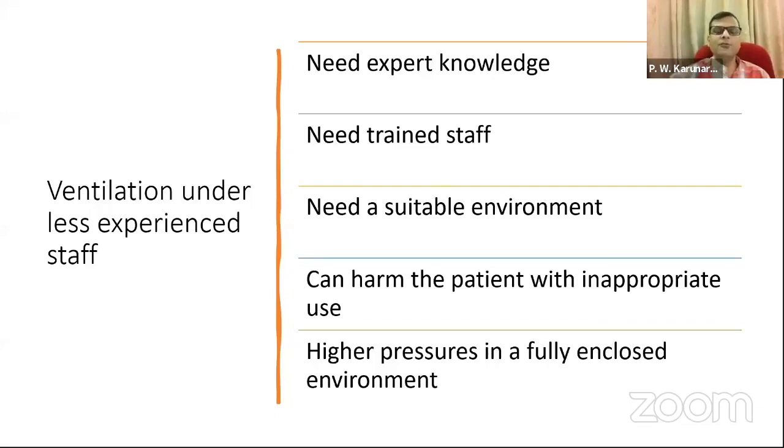At the same time, if you use these portable ventilators inappropriately, they can harm the patient very easily, because, as I told you last time, in an invasive ventilator there is no free flow of air or oxygen coming to the patient. The patient must tell the ventilator, or the ventilator must open the valve to give oxygen or airflow to the patient. So intubation is a special situation. Once you do that, it's a completely enclosed environment. Unless the ventilator opens the inspiratory valve and provides some flow, the patient cannot breathe. They can try to breathe, but they won't get any air from the ventilator.